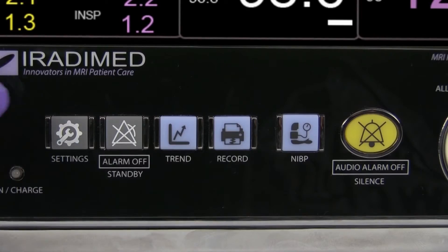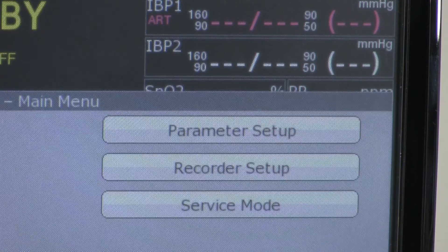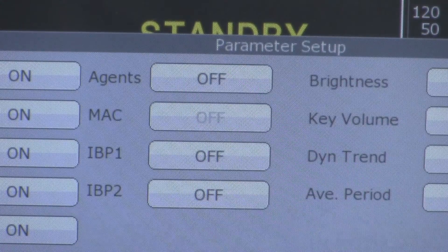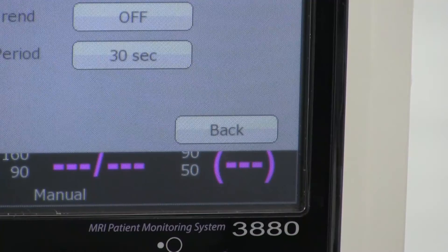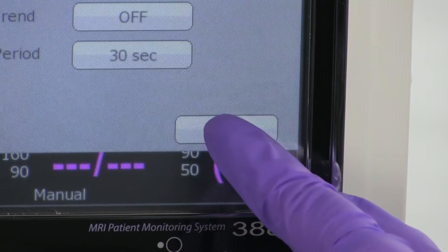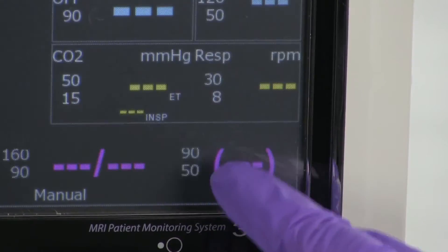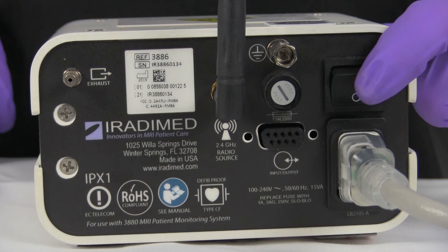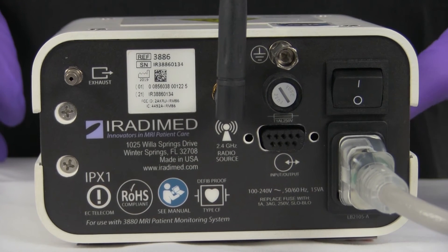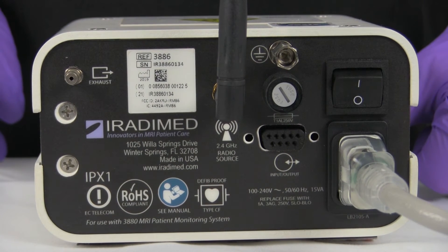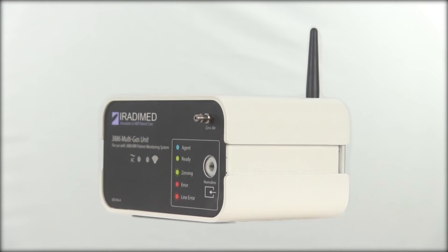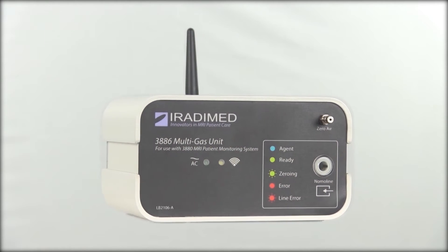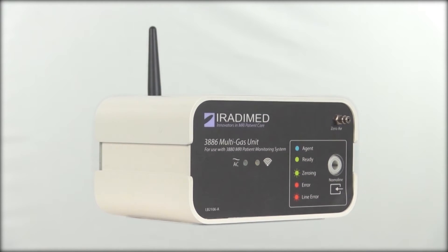Finally, the user will press the settings button, press the parameter setup button, and change agents from on to off. The user will then press the back button twice to return to the monitor screen. The user will then turn off the gas unit by flipping the switch on the reverse side so the bottom half of the switch is flush with the bottom of the box. The patient is ready for recovery, and the multi-gas module is ready for its next patient.